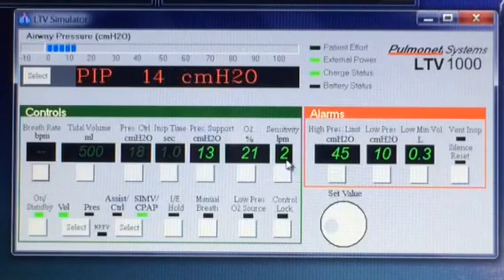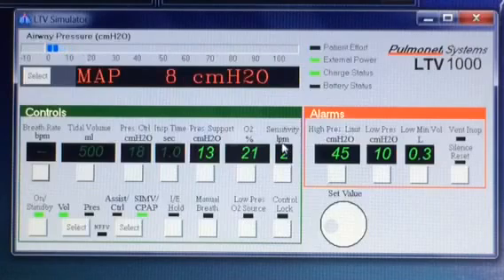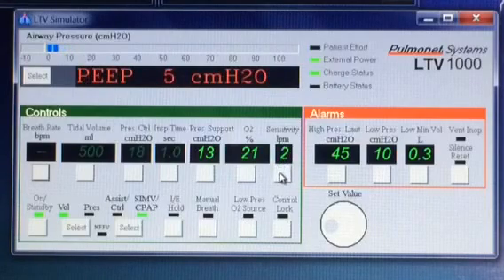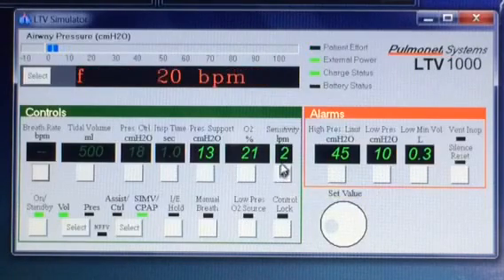First of all, it's the sensitivity. In this case, it's at 2 liters per minute. If they pull in 2 liters a minute of air, that tells the machine that they want a breath.